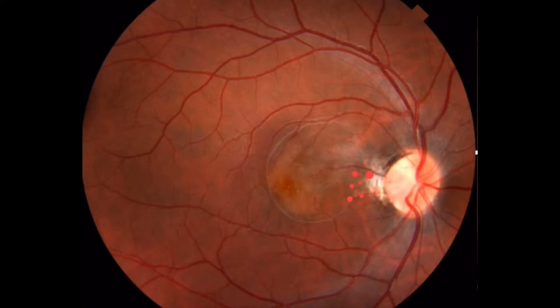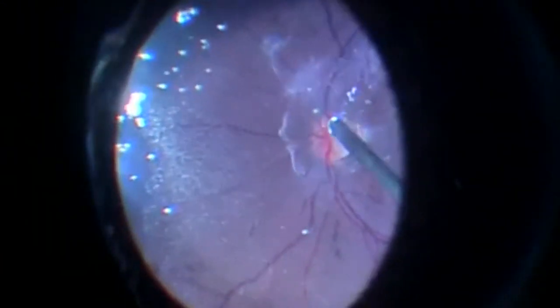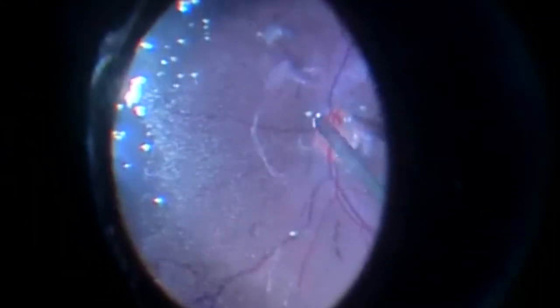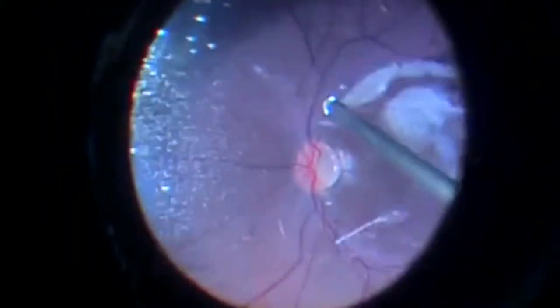The key point in these cases is to perform removal of the posterior hyaloid interface and all traction in the peripapillary zone. The surgical steps are not easy to perform in young patients, and you can use triamcinolone to improve vitreous visualization.